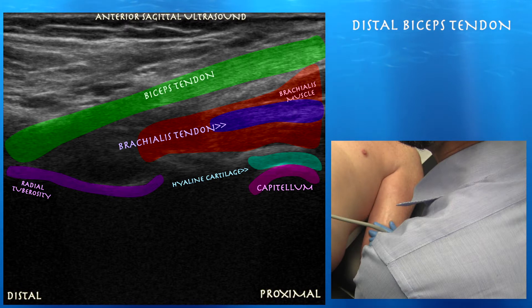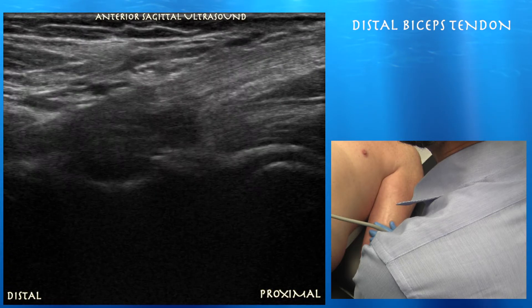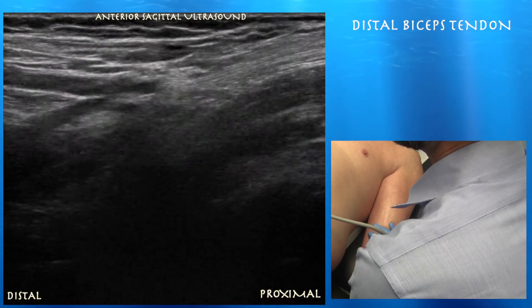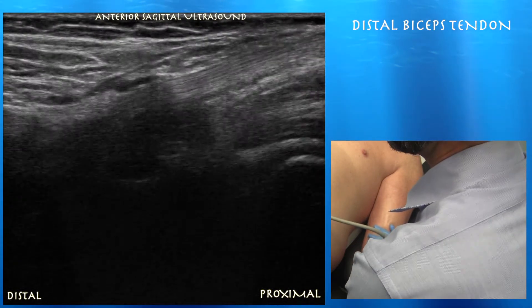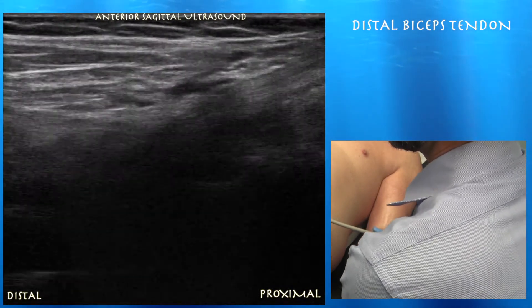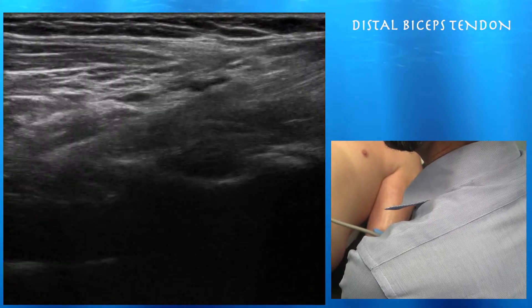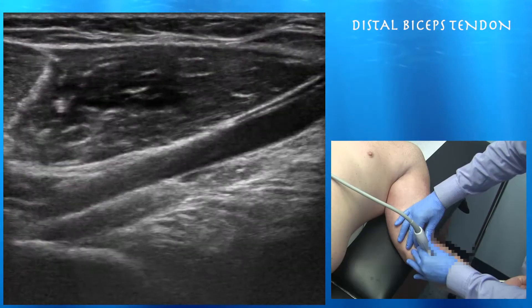This is your typical anterior approach where it can be challenging to get a complete view of the biceps tendon as it dives deep and inserts on the radial tuberosity. You also get challenged with anisotropy to actually see that distal biceps tendon, which you can see here.